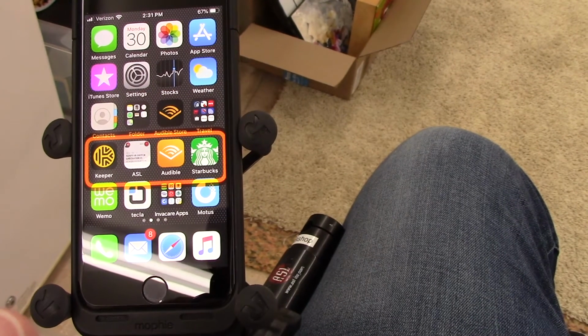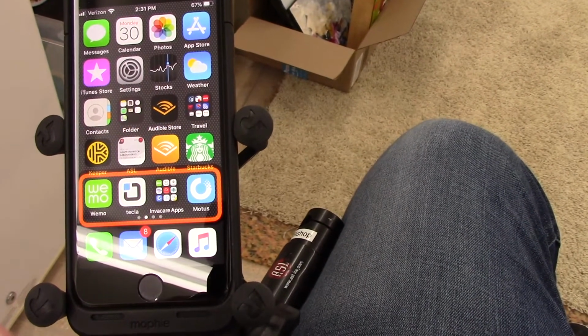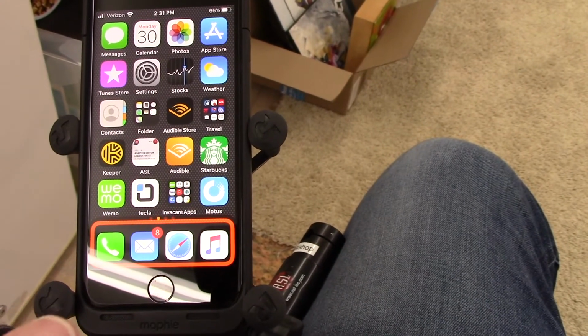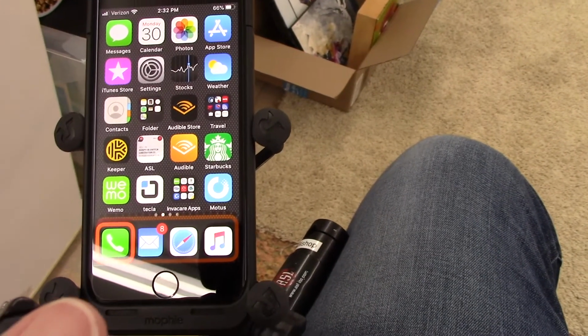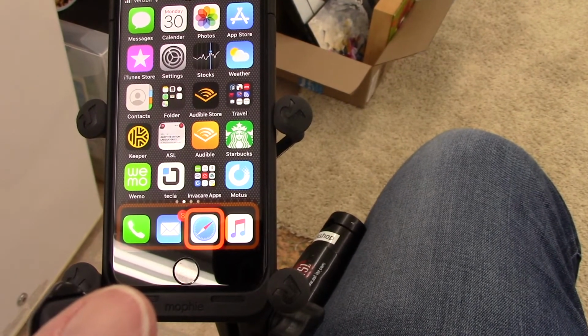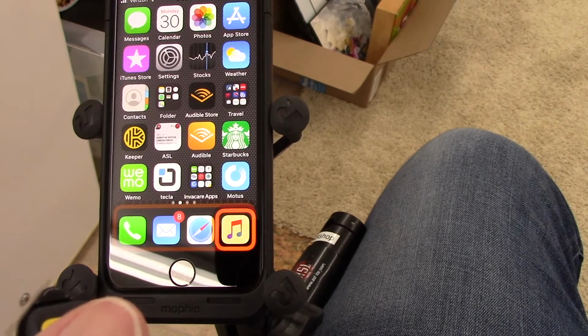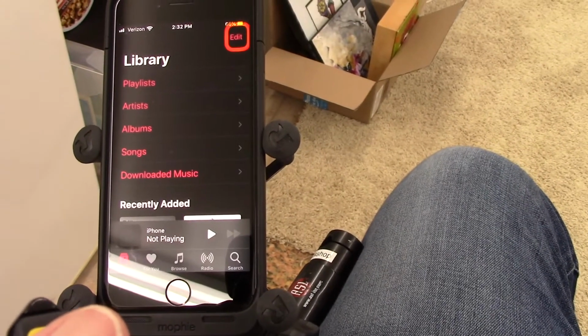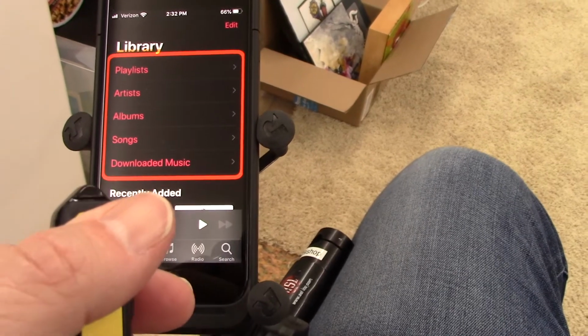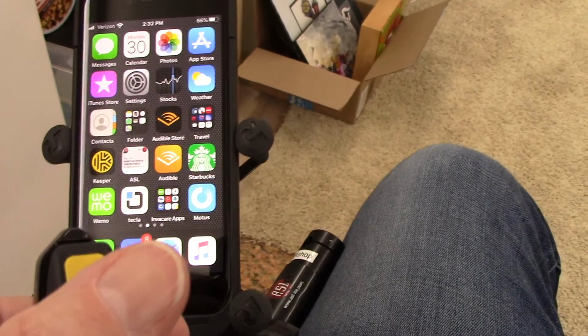Sorry for the glare. You can go into there, scan over to music. I don't think there's anything in there. Open up the music. So I'm controlling my phone with that same switch that I've been driving with. Long hold on it. Takes me home. Okay? So now I'm all done with my phone.